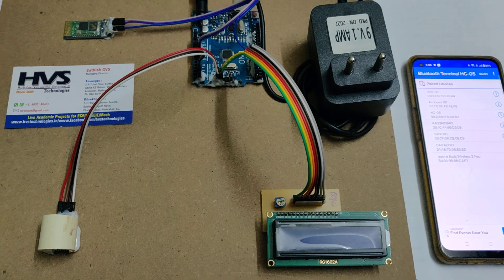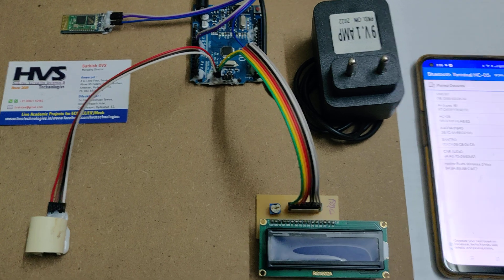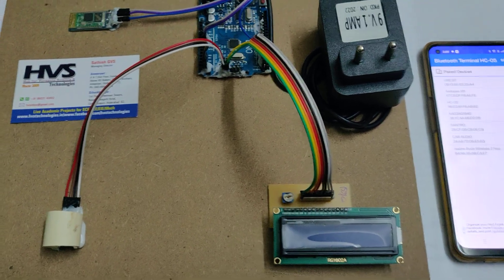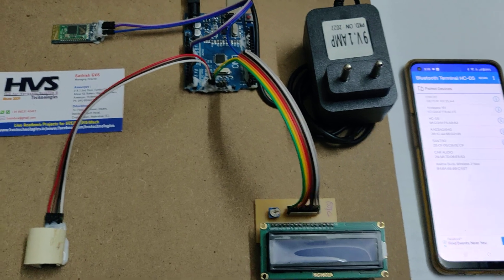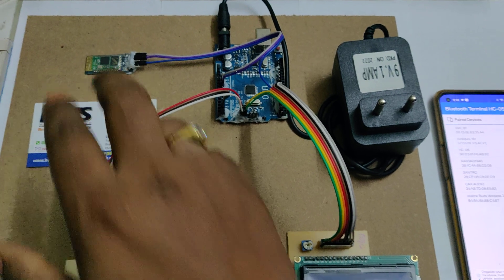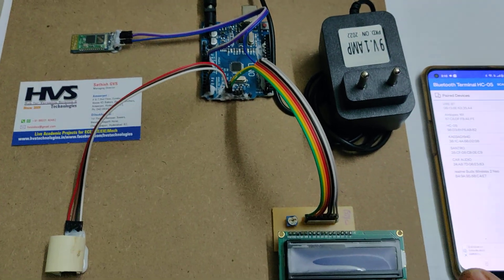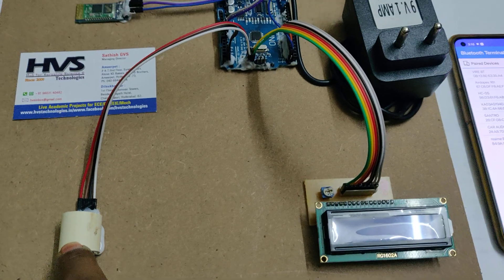From this sensor we detect the finger first using an IR sensor, and using a red LED we get the intensity and density of the blood inside the finger. Based on the density of the blood, we provide the approximate glucose levels, which will be displayed on the LCD screen. The same details will also be sent through the HC05 Bluetooth module to the mobile phone.